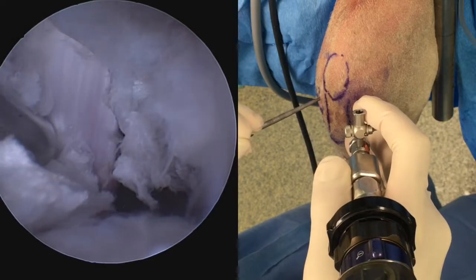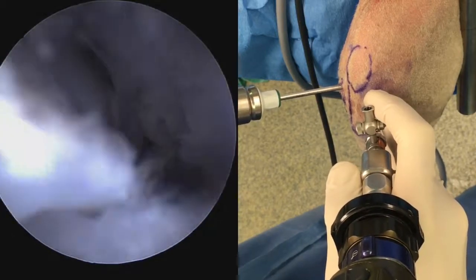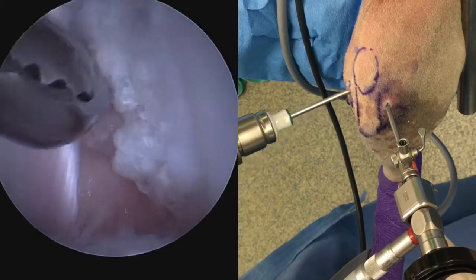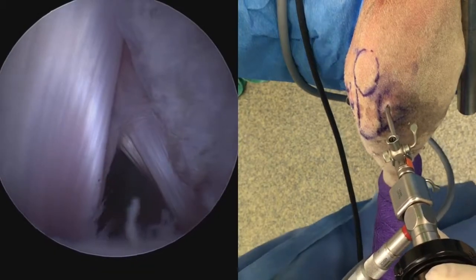Probing should be performed to confirm complete transection, and the stumps of the cranial cruciate ligament are shaved down with an aggressive shaver, being careful not to injure the caudal cruciate ligament and the caudal meniscofemoral ligament, as seen here.